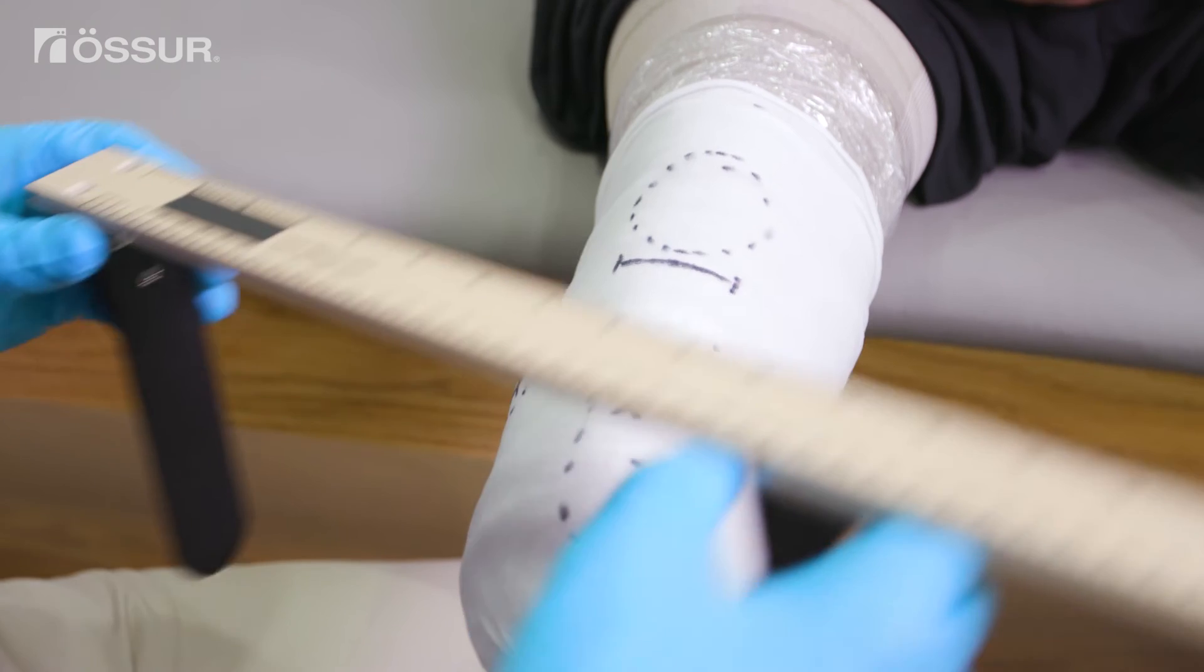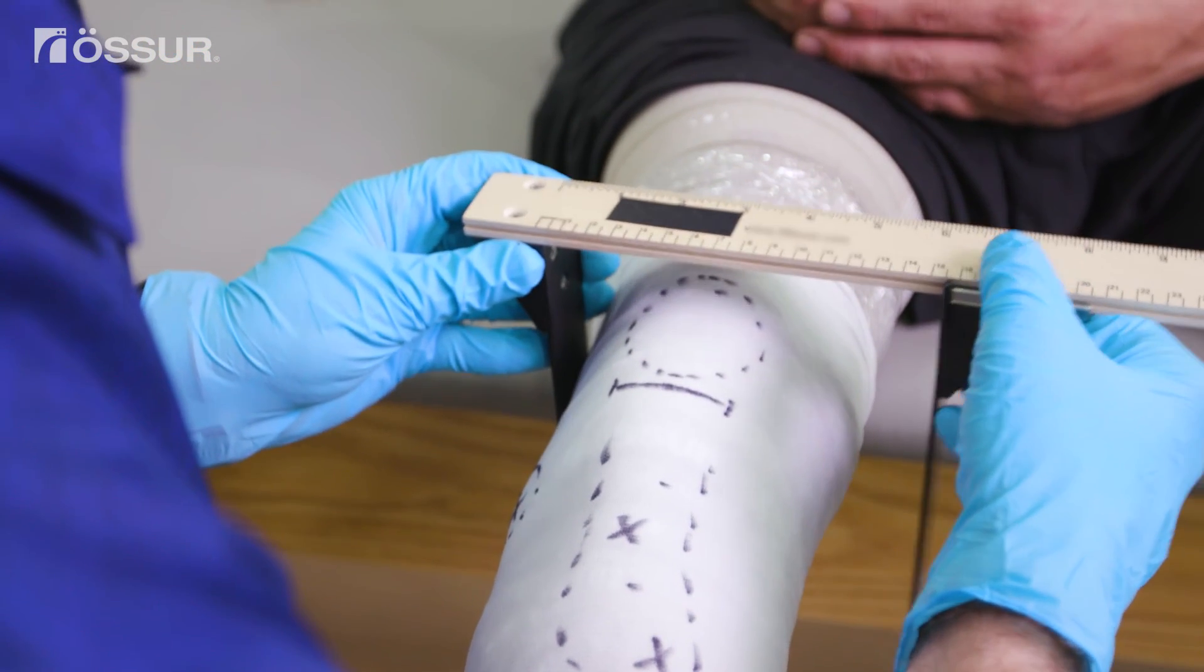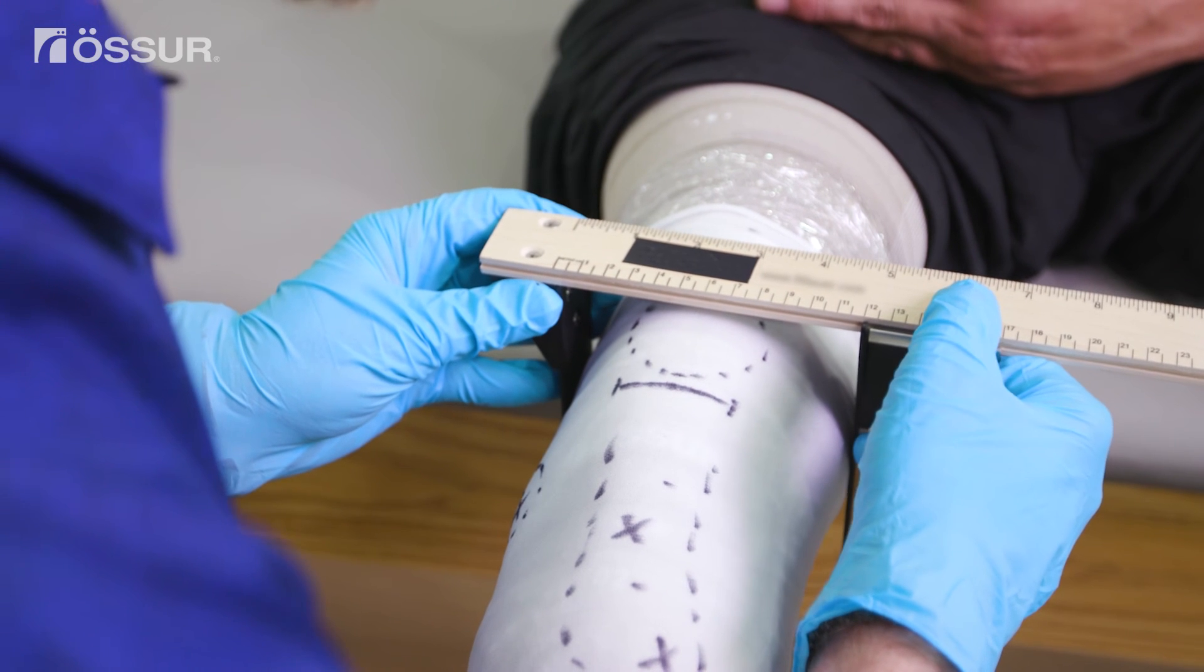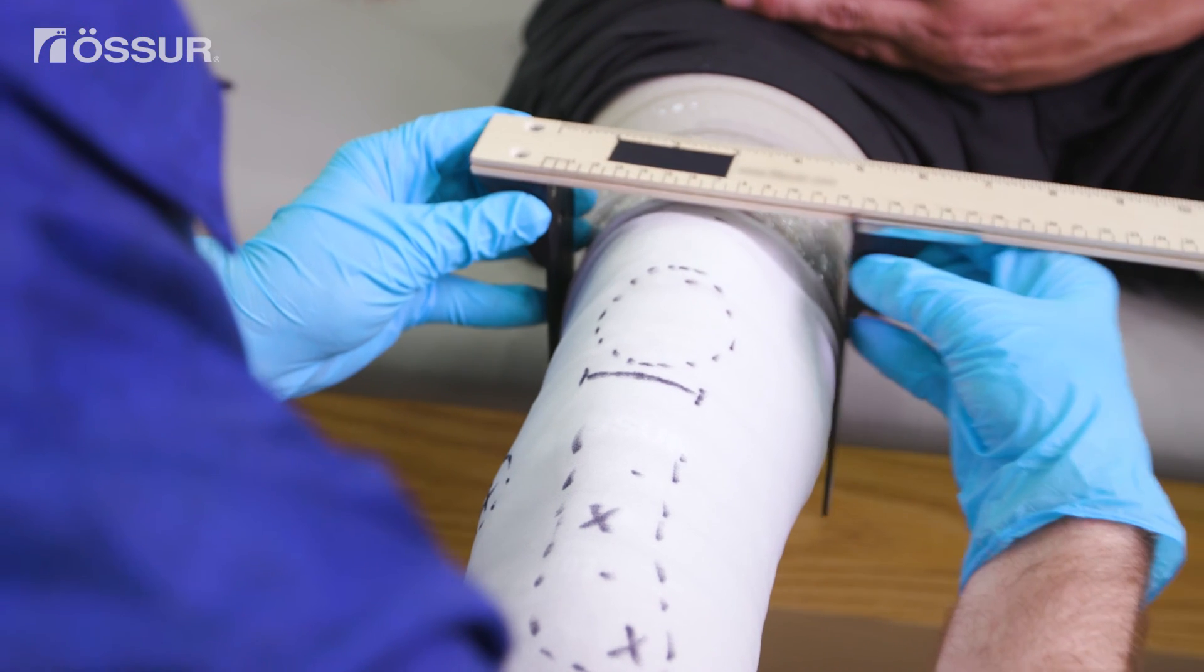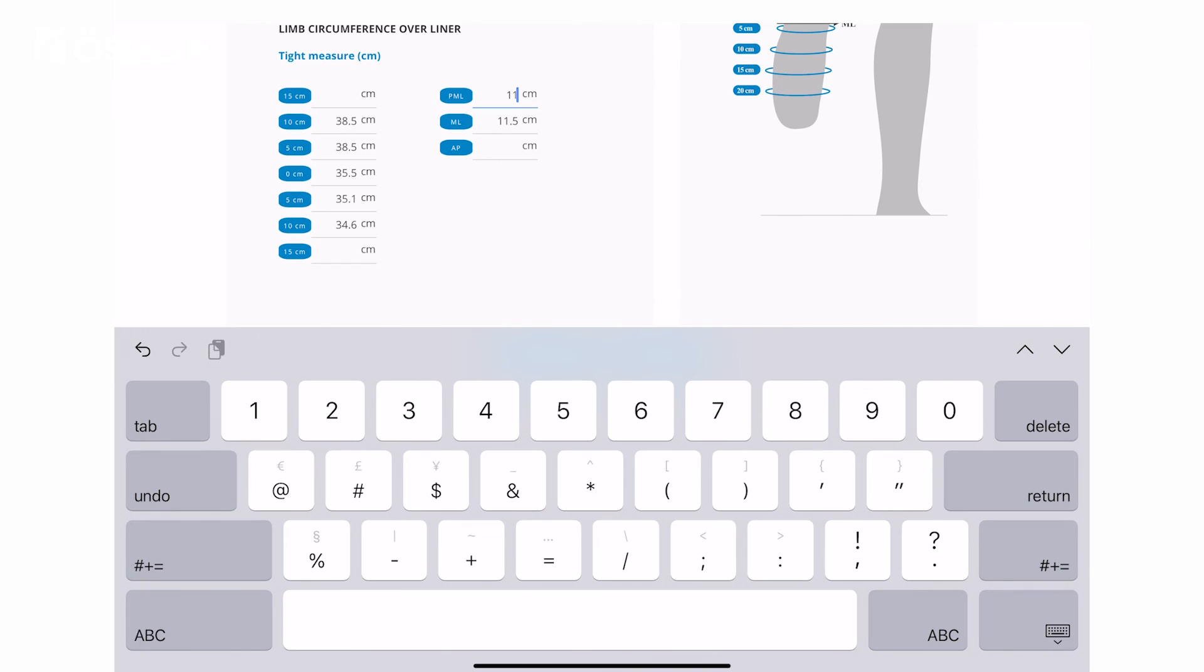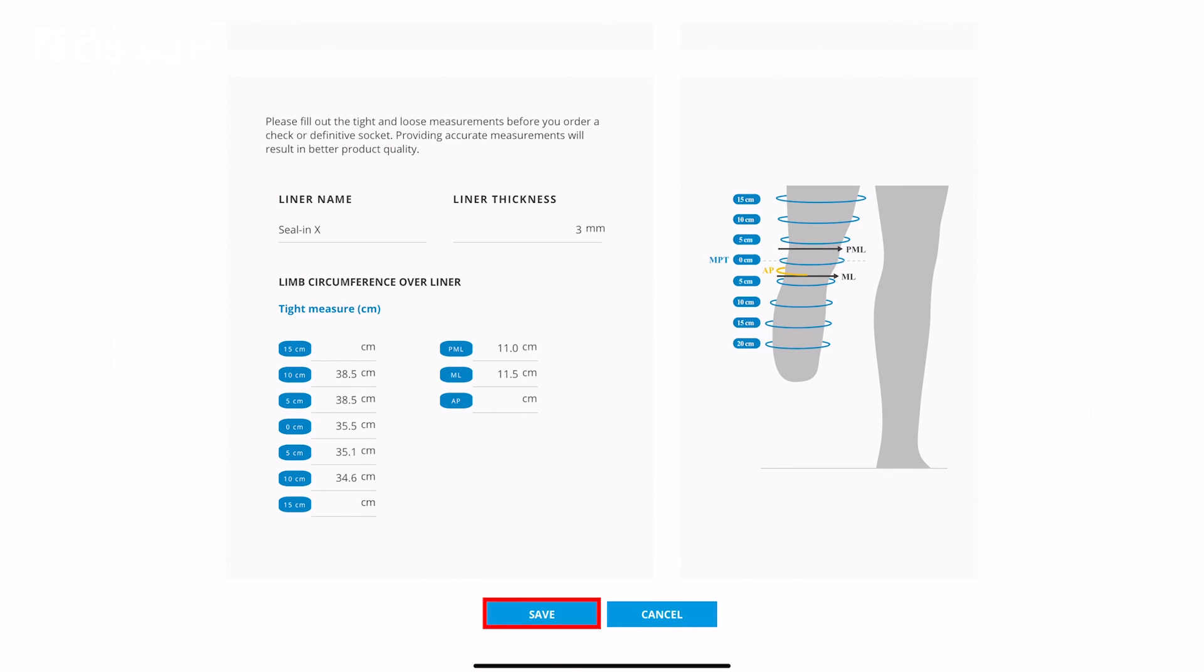After completing circumferences, measure the medial lateral distance, even with the condyles, using an ML gauge. Then measure the proximal medial lateral distance just above the condyles. After inputting all the fields, press save, and the information will be stored inside the portal.